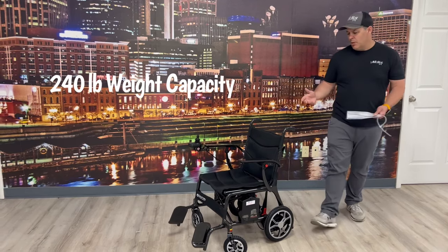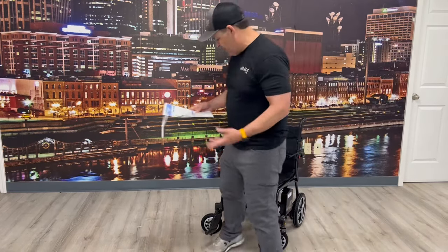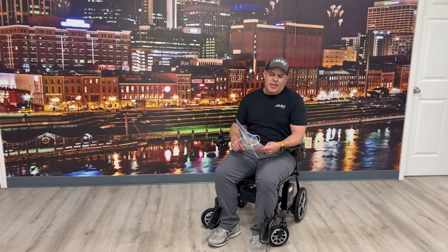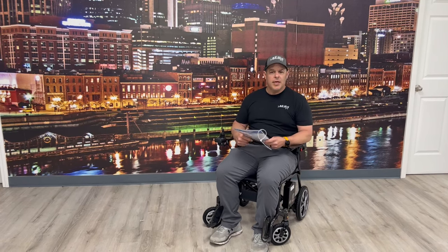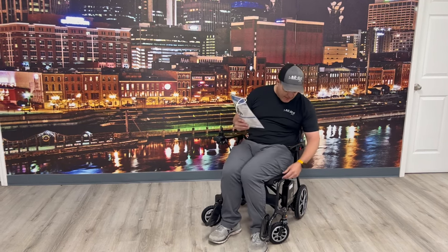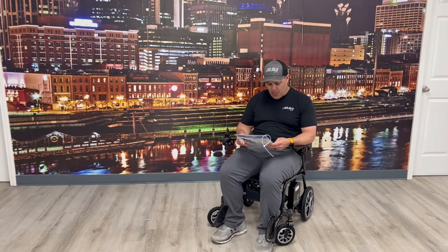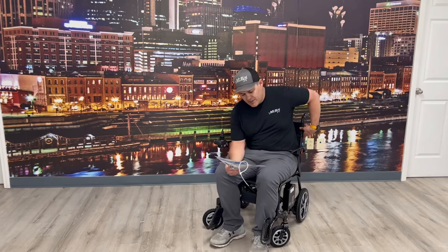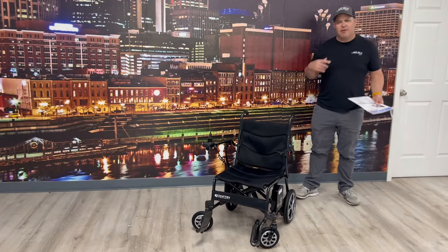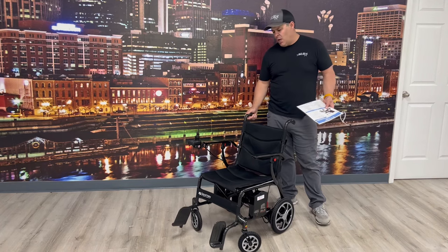Probably the biggest thing people need to know about this chair is it has a 240-pound weight capacity. I'm 5'8" and when I sit in it I've got plenty of room. I would say if you're over about 5'10", this chair may be a little small for you, but anyone 5'10" and under should be fine. The seat width is 16.5 inches, but the width between the arms is actually almost 18 inches. Seat back height is 15.7 inches. Maximum speed is right at 3 miles per hour — the average person walks about 2.2 — so it's fine to walk alongside people.